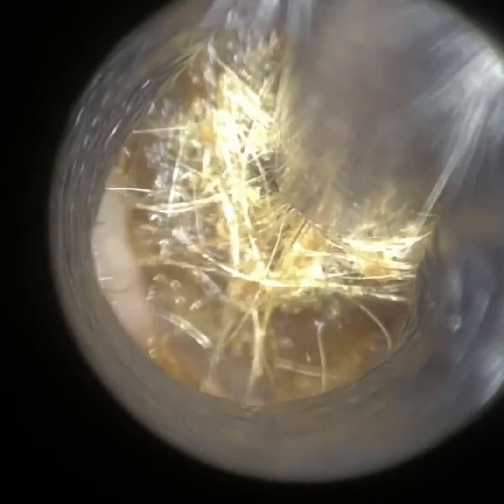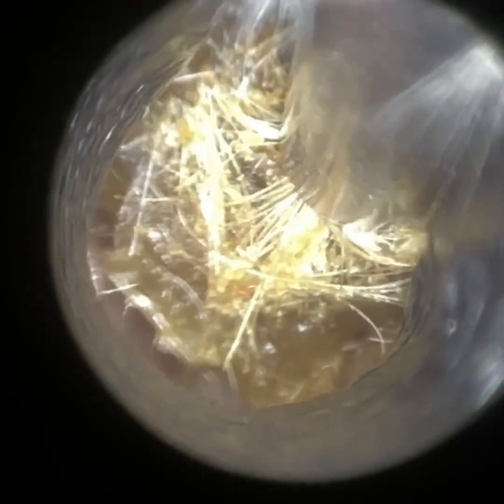You can see there are loads of matted hairs that almost look like straws. I just went in with the Zolna Suction Pro, but very early on I realised this is not going to come out with suction.